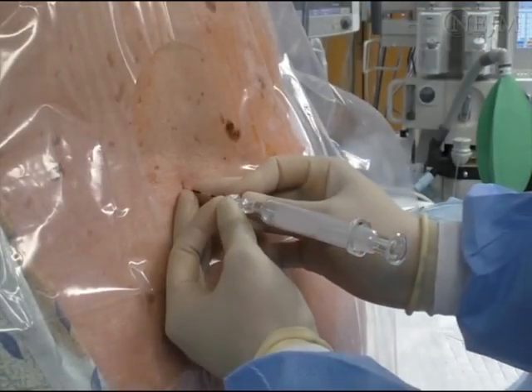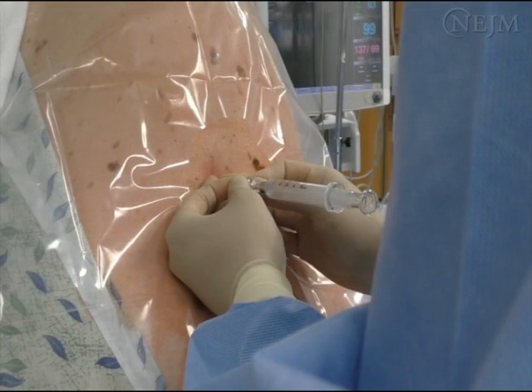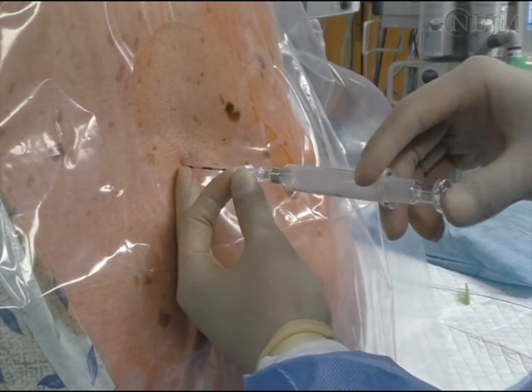Next, slowly advance the epidural needle in small increments of 2 to 3 millimeters at a time. After each advancement, check for the presence or absence of resistance by gently tapping the plunger with one hand.